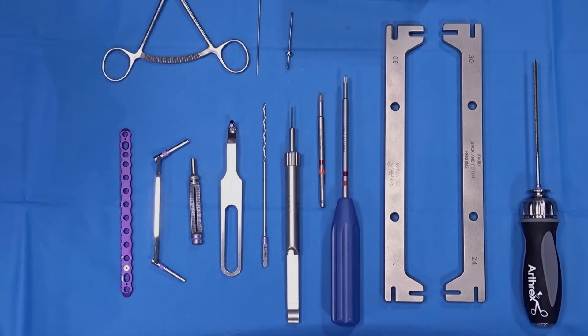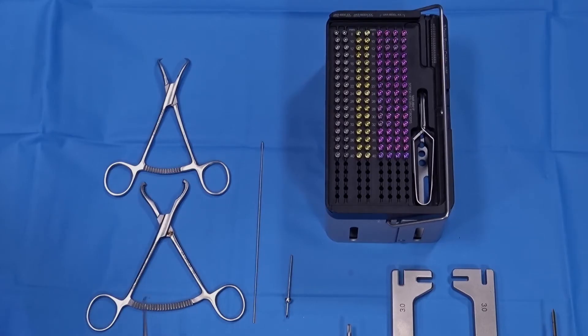A 3.0 tap is included with the set for hard cortical bone. Standard reduction forceps are also present for temporary plate fixation. A standard K-wire as well as a BB-TAC anchor are provided. The screw box contains cortical, variable angle locking, and locking screws.